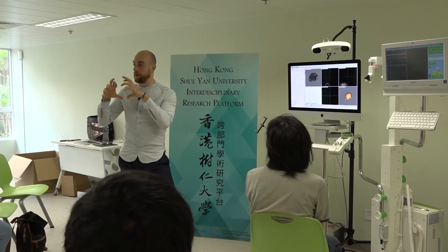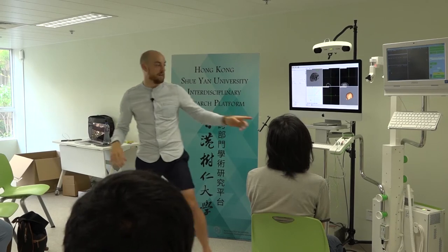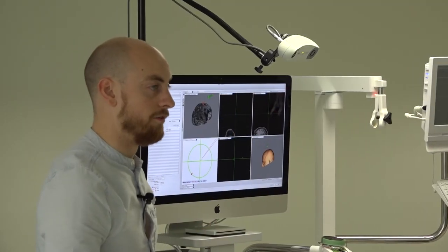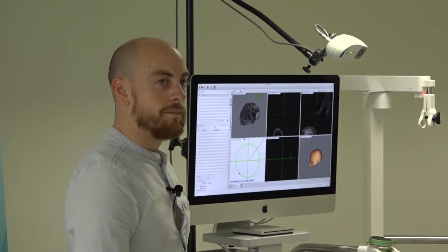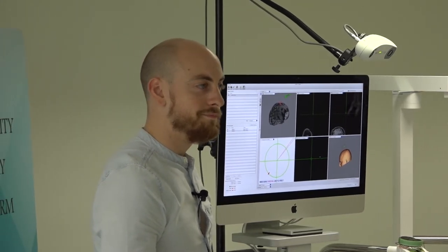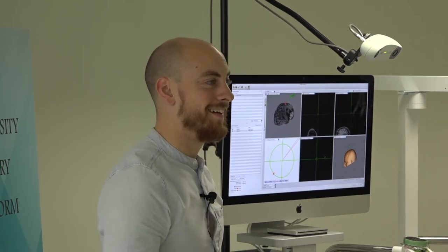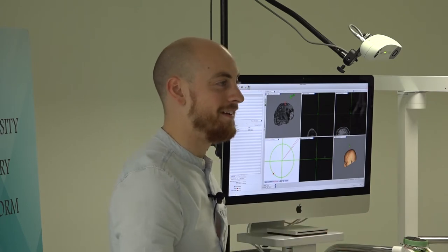You'll be able to filter out those movement artifacts, because in the EMG they'll come up as something a bit different. So you can apply a filter and remove those movement artifacts. You're welcome to have a go with it and try to orientate the coil in the right way.